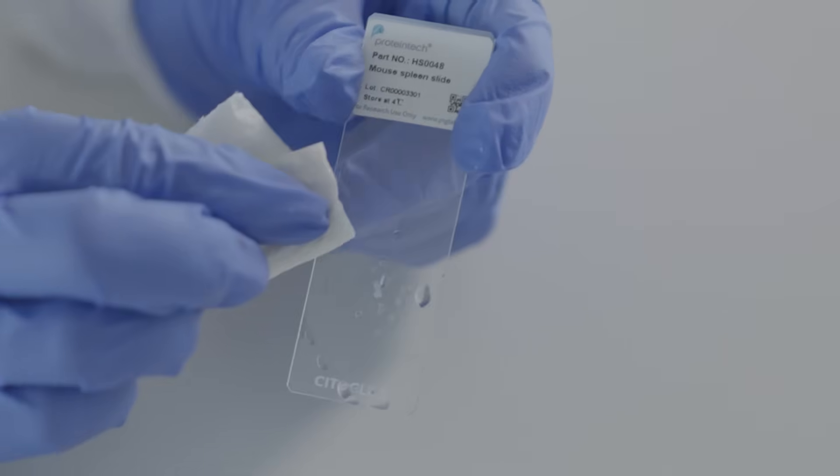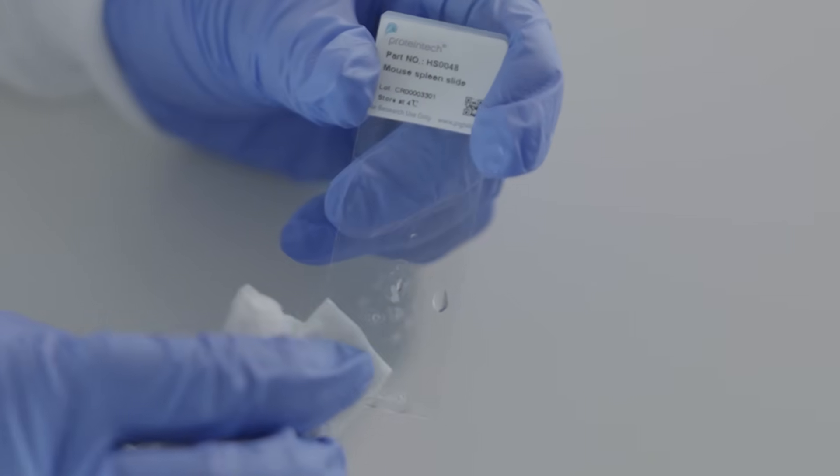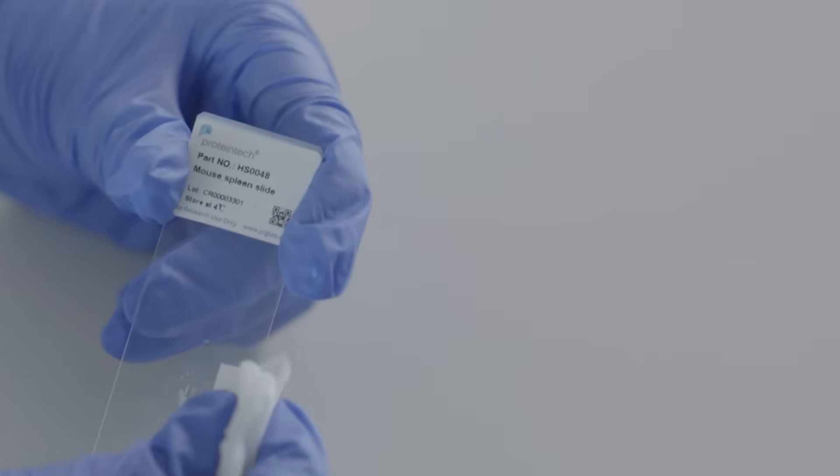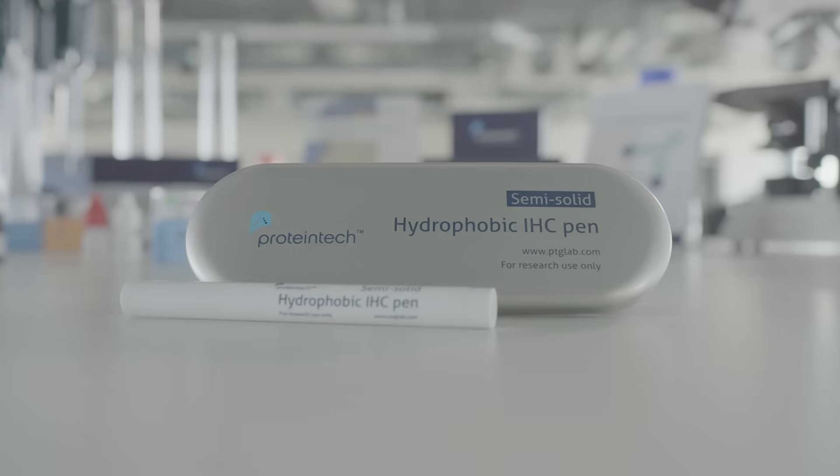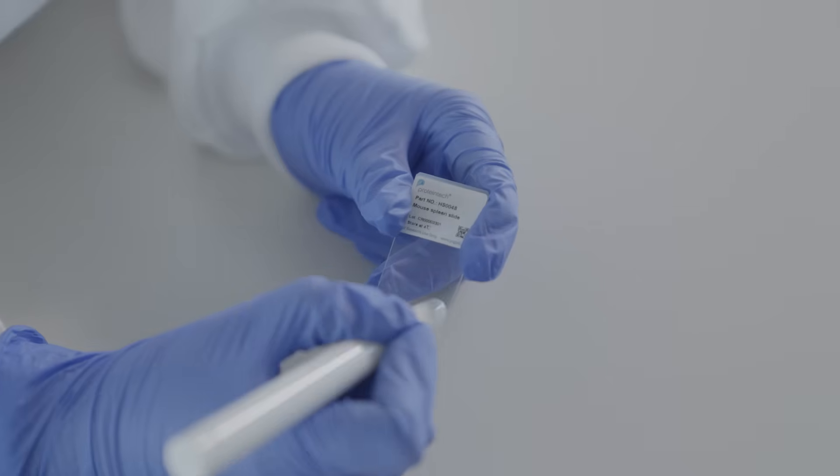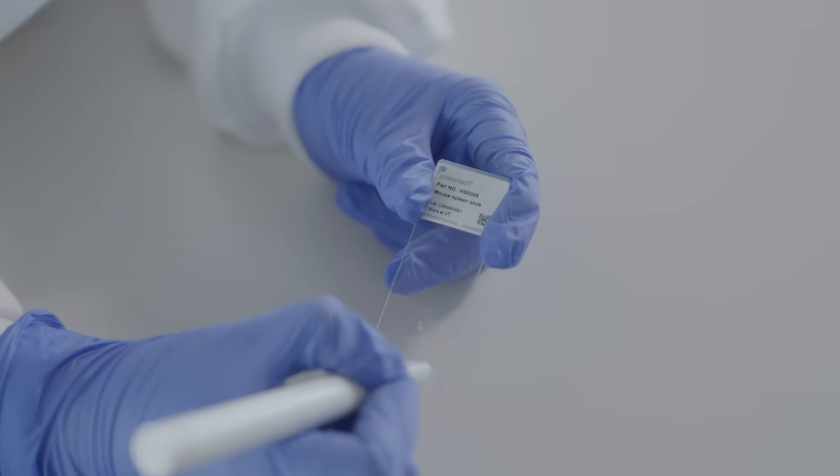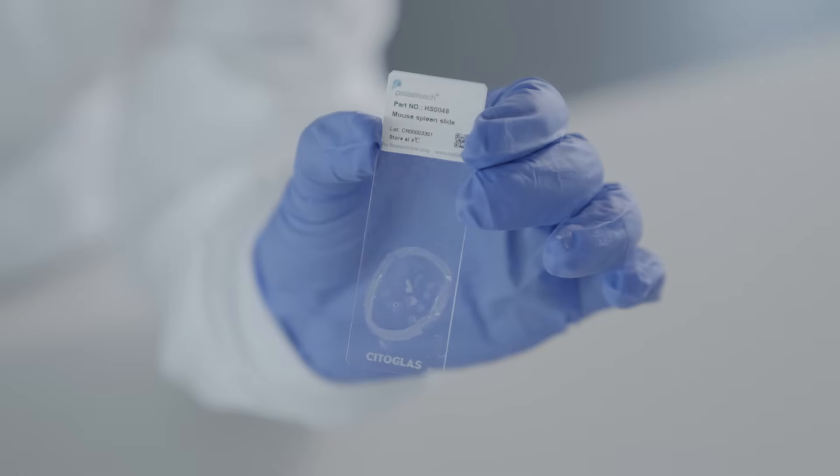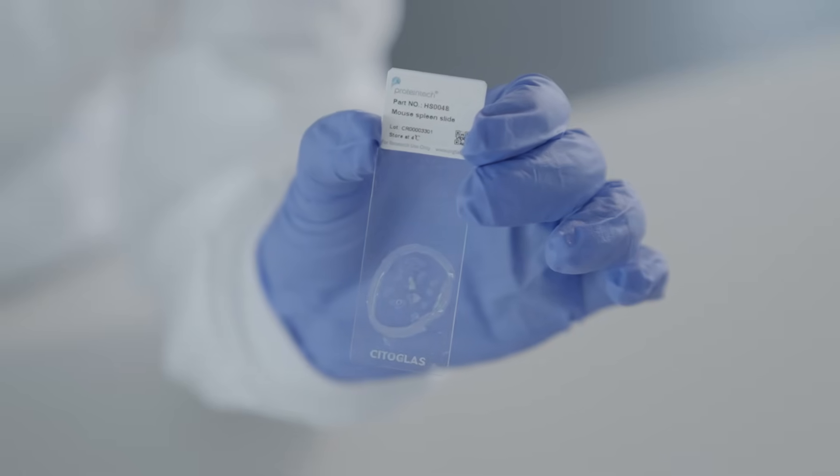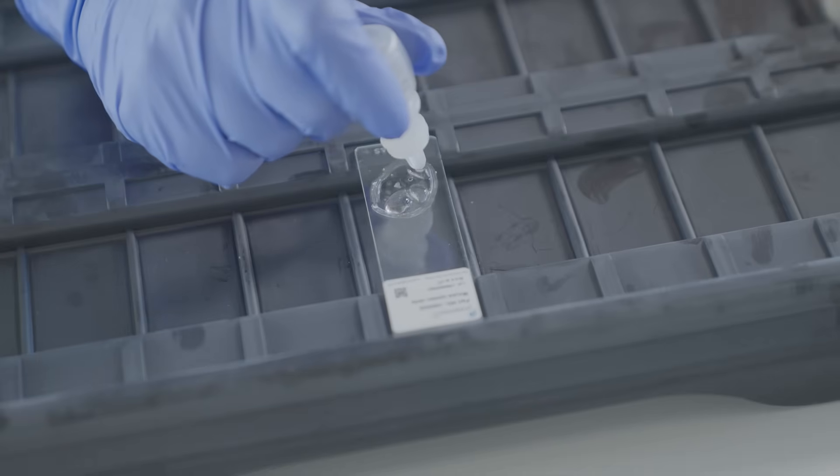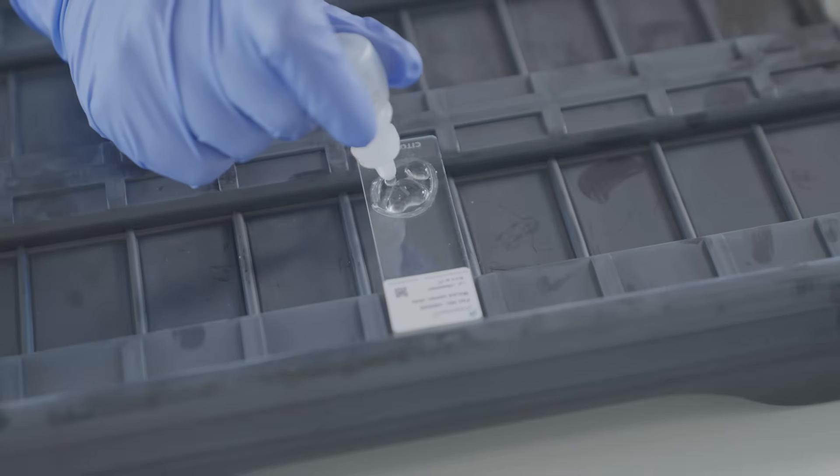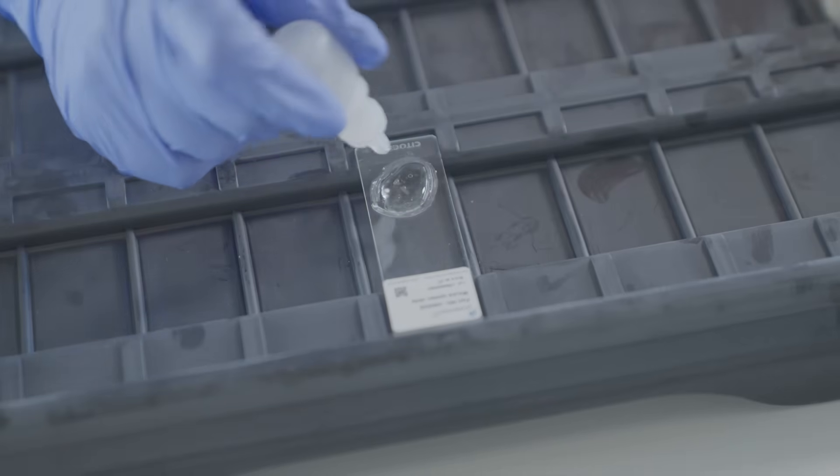Dry any remaining fluid around the tissue with absorbent paper. Use a hydrophobic pen to draw a closed circle around the tissue. This creates a hydrophobic boundary to confine reagents to the tissue. Block each section with blocking solution for 30 to 60 minutes in a humidified chamber.